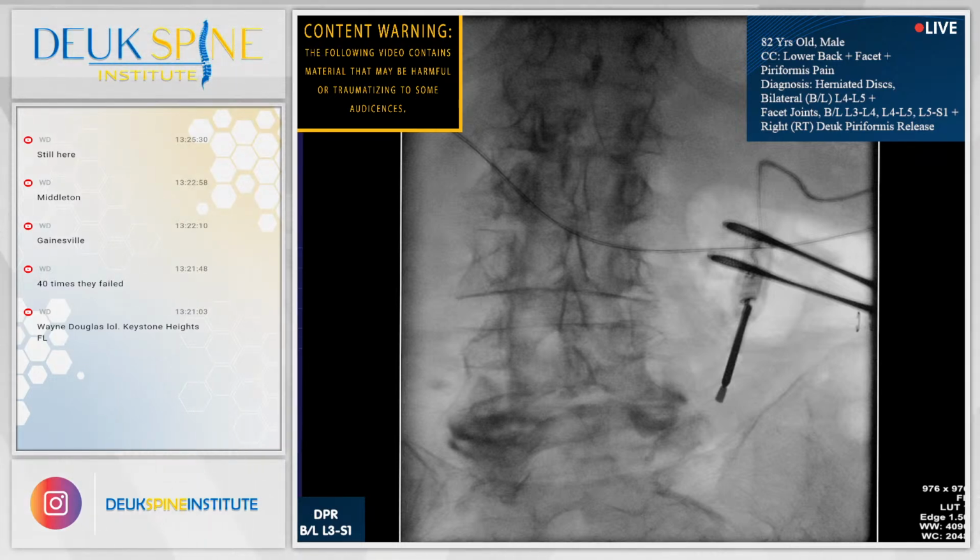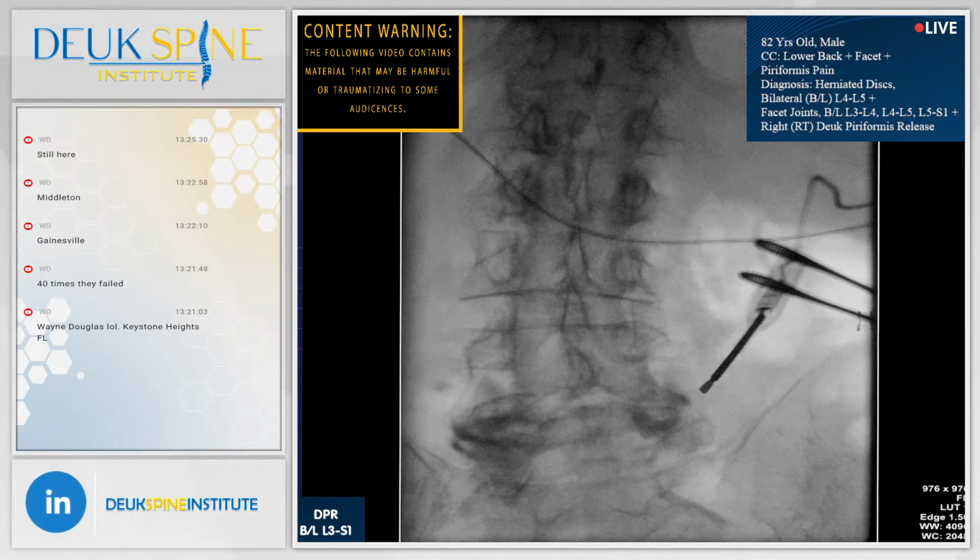So what I'm doing is I'm using the x-ray machine that you guys are seeing. I'm using those picture shots to find the pain nerve and deaden it. And there's a name for this nerve. It's called the medial branch of the dorsal ramus. And as a neurosurgeon, which is my training, you know where these nerves are, and I know now how to destroy them. We are normally taught as neurosurgeons how to not destroy nerves, but there are times when you need to destroy a nerve, especially when it's a bad nerve.